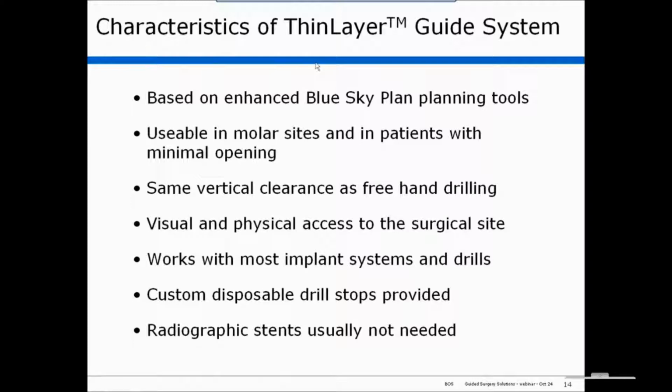Okay. At this point, I think I'll just review the characteristics of the Thin Layer guide system, that it's based on the enhanced Blue Sky Plan planning tools. We need a model and a plan of the case. It's usable in molar sites and in patients with minimal opening. Requires the same vertical clearance as freehand drilling. You have physical and visual access to the surgical site. Works with most implant systems and drills. Custom disposable drill stops are provided, and radiographic stents are usually not needed.